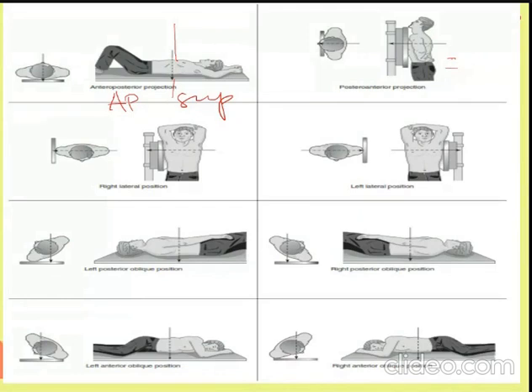We have here the lateral position. What kind of lateral is this? Right lateral position or left lateral position? Right. So, right lateral position. Very good. How about projection? What kind of projection is this? Left lateral projection or right lateral projection?